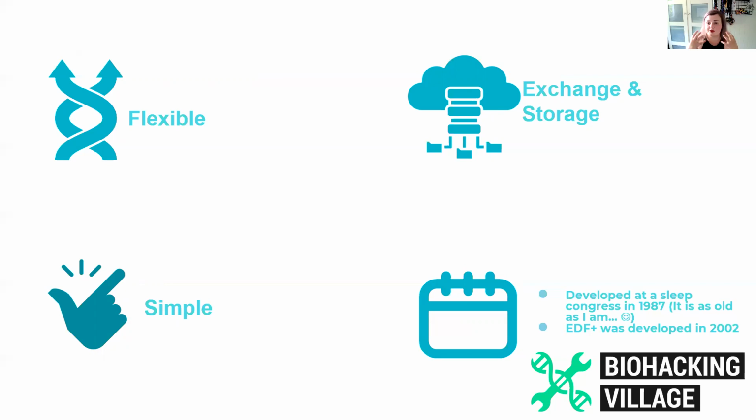Was his eyes open? Was it closed? Was there any events where he stopped breathing? So this is quite a very standard medical format, and it's also very well documented. But the best thing about EDF files is that it's actually in printable US ASCII. So you can actually read some of the data with just something like a hex editor.